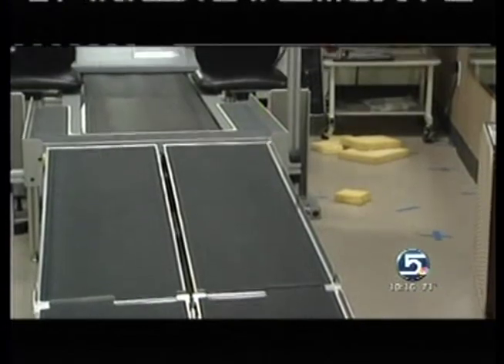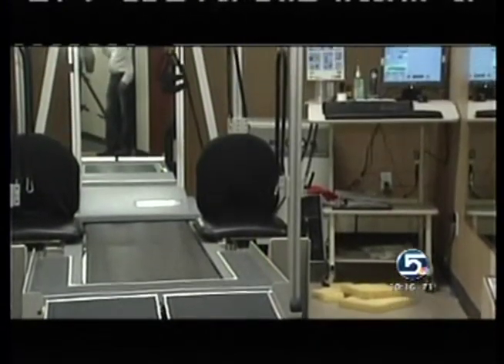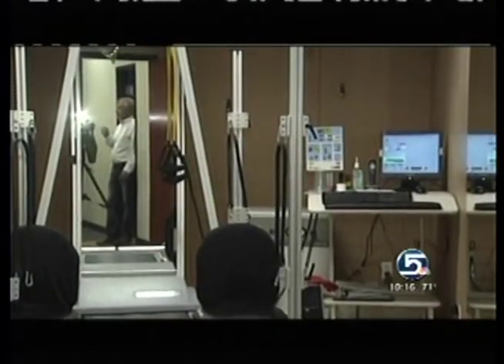So what's behind this device that became part of the Christopher Reeve Neuro Recovery Network about 7 years ago? When we lean forward and stand and walk, we're firing reflex pattern muscles triggered by our spinal cord memory. The cells of the spinal cord are set up in a network where they remember those actions according to the sensory input that's going to be given to them.